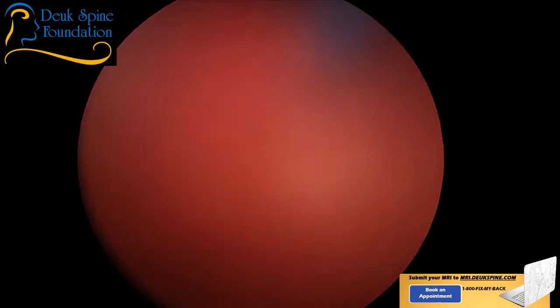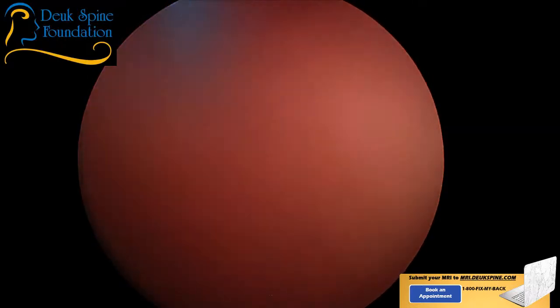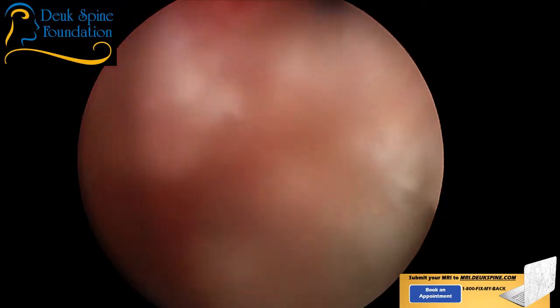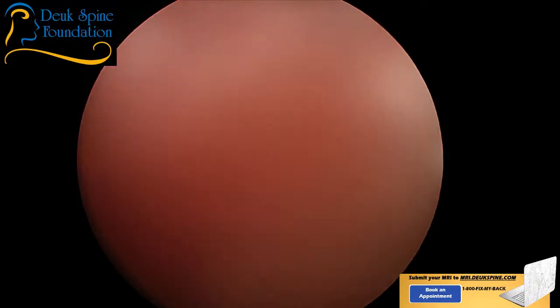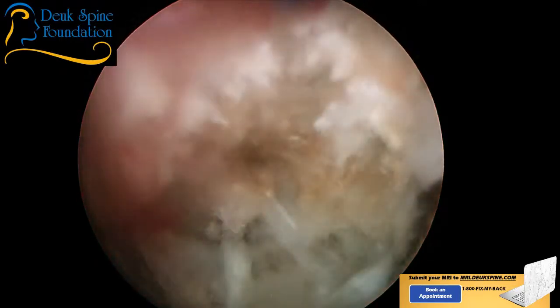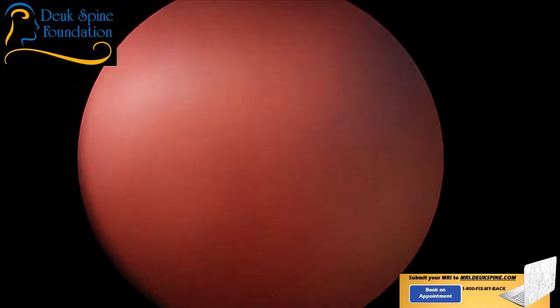Pull the fluoro back. It's hitting the laser cable. Come on, faster. All right. How is she doing? What is it? 120, just off the 120. I want to get back down to 105. That's where I want it, but it'd be nice if it was. Probably wouldn't have as much oozing. And the irrigation is cold, right? It is.